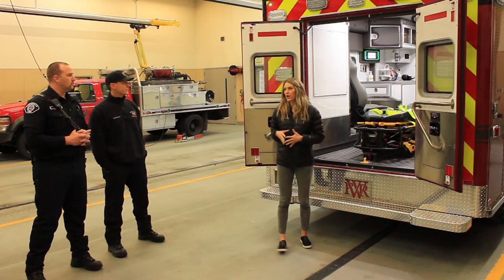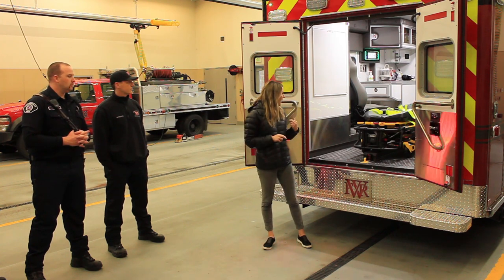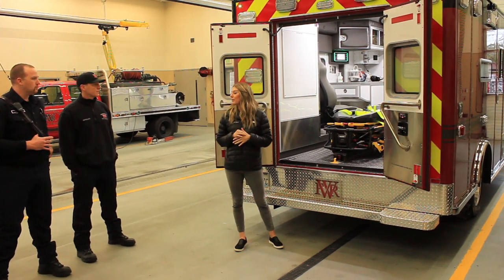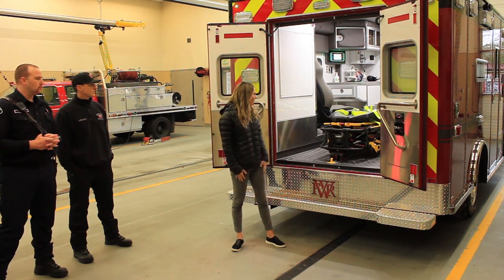I'm going to go over the normal operation for the power cot and the power load. I know you guys don't use it much because it's on calls, but mostly this is going to be troubleshooting. If you have any questions, feel free to stop me, but there's a chance you're going to get to it, so just be patient.